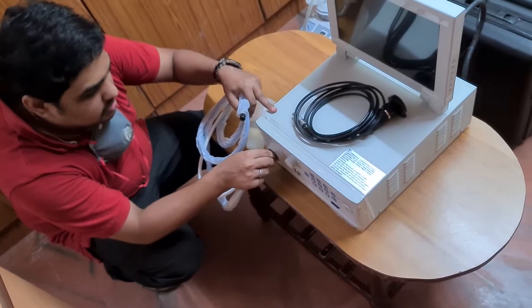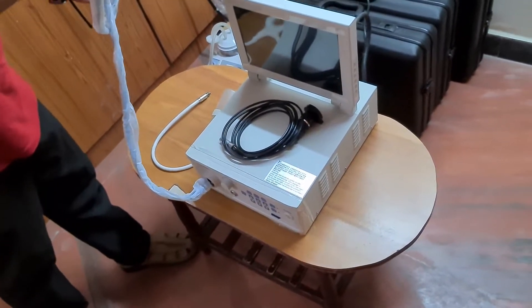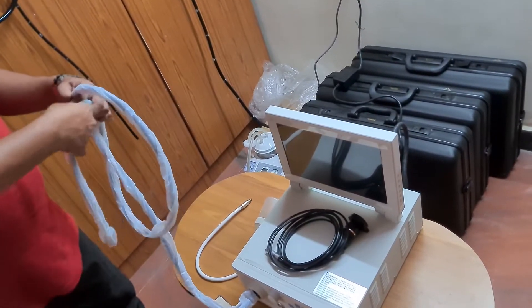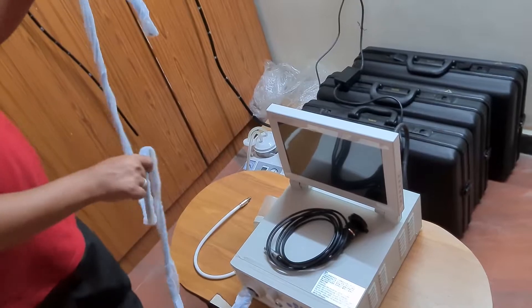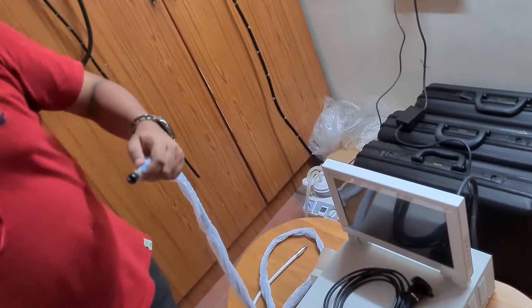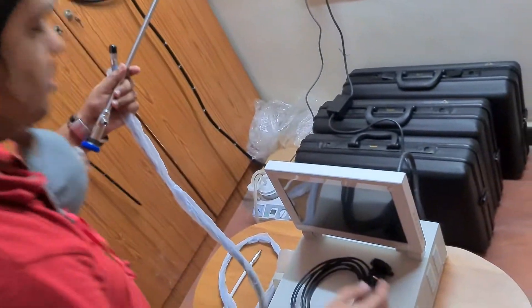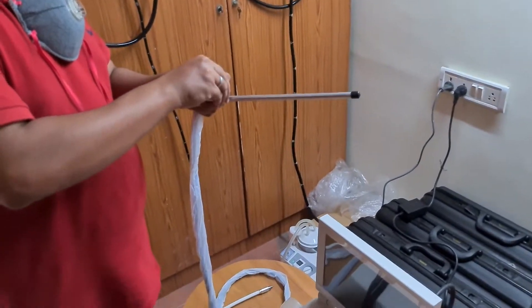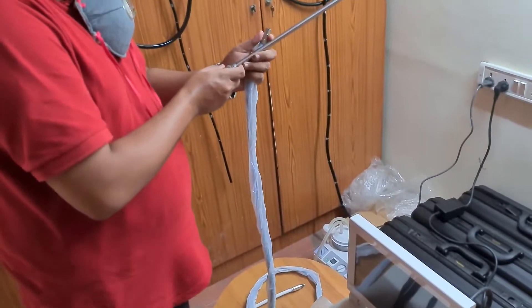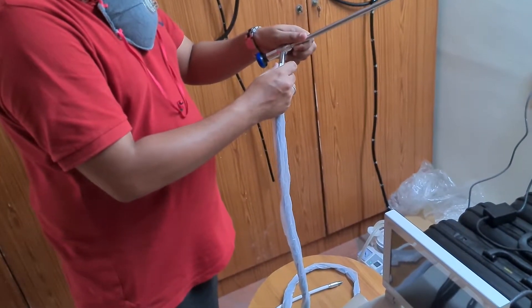Press it in — that's it, the light guide connection to the processor is done. The other end of the light guide you are going to connect on the scope. This is the zero degree laparoscope. Be sure to remove the tip and keep it safe so that you have it after the procedure. Make sure to connect it properly and rotate it clockwise.